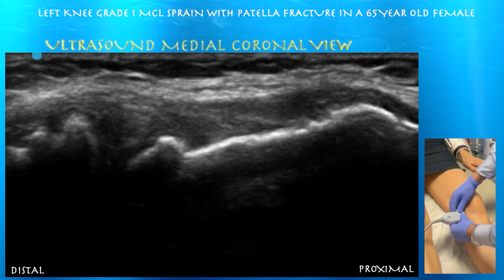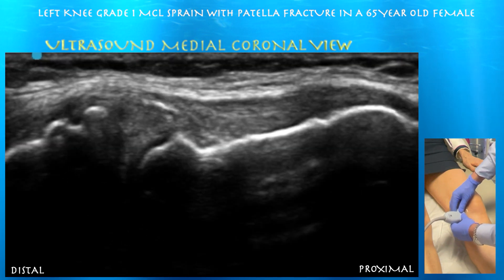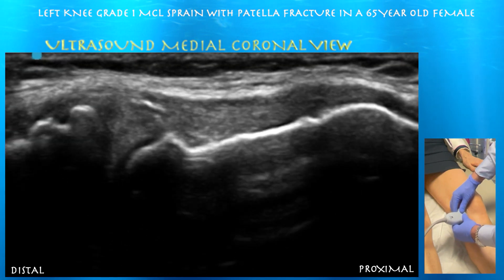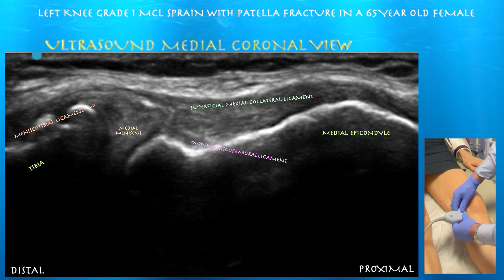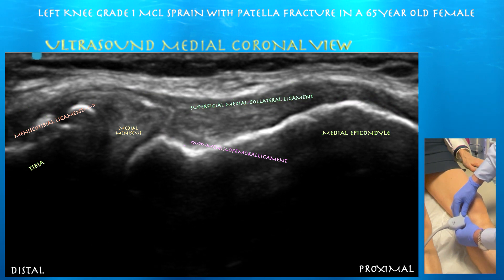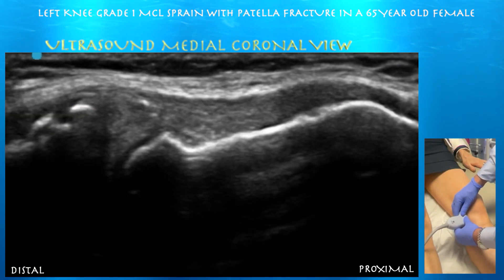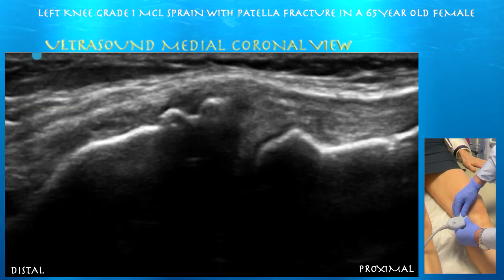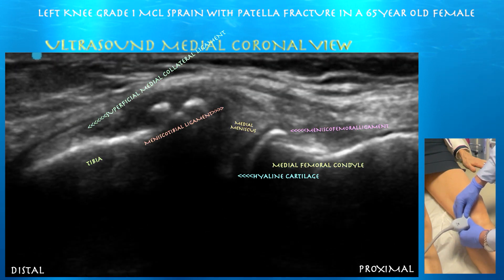At her joint line, I don't really use ultrasound for meniscal issues, but you can see a nice triangular meniscus there. I really use MRI to evaluate the meniscus. There are some osteophytes of that medial tibial plateau, which you can appreciate at 50L7, kind of jutting into the MCL a little bit.